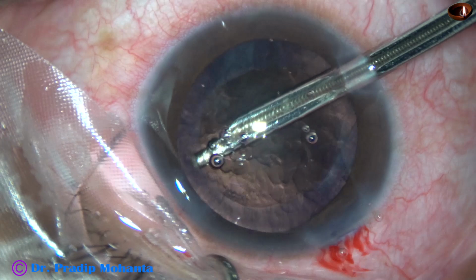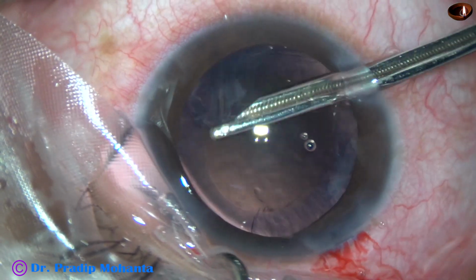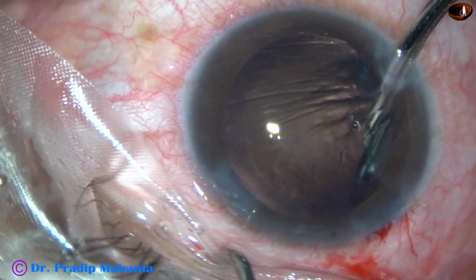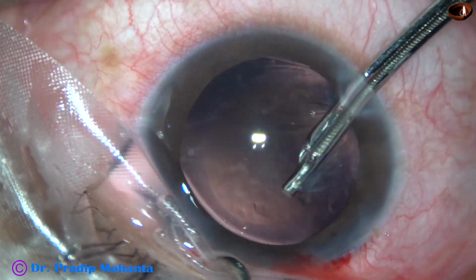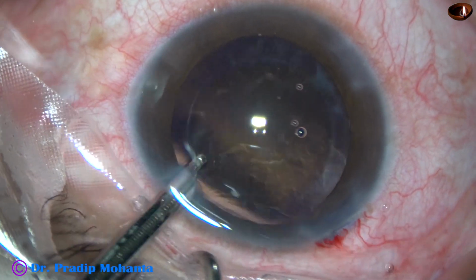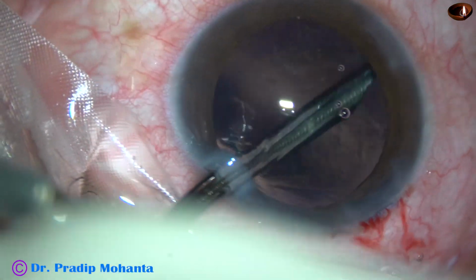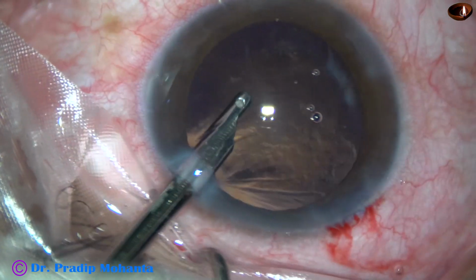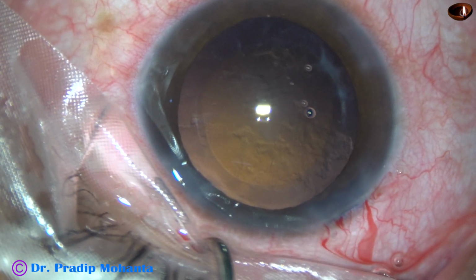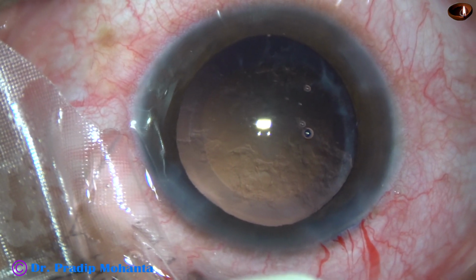So in this case, the nucleus has been managed by this time. Now the cortex is being cleaned with the help of a 23 gauge Simcoe cannula. The Simcoe cannula is working through the right side port at this time, and now it goes through the left side port, and cortical matter is removed. But see, in this case, a lot of cells are sticking to the posterior capsule. It happens in some cases with intumescent cataracts.